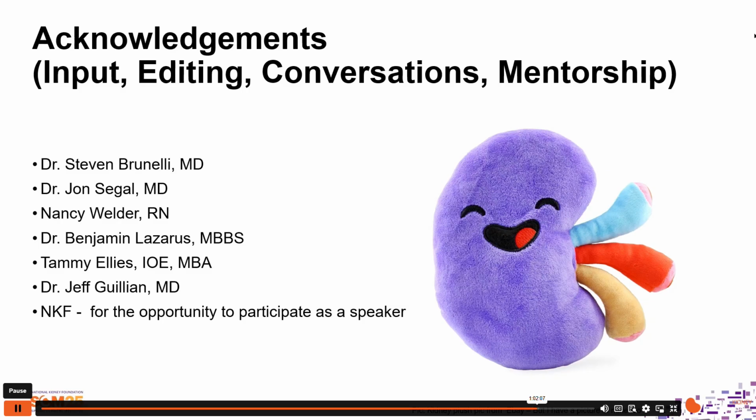Another point was that your pictures show the hub and the connectors exposed. Good reasons for that. You don't want that thing to come loose and bleed. I was talking to a home dialysis nurse who related to me a patient who had 3 successive Capnocytophaga sepsis events and did a home visit. And here's the patient with the exposed connectors, sitting back in her chair, asleep, cuddling her cat, who is licking the connector. Okay, so again, real world.